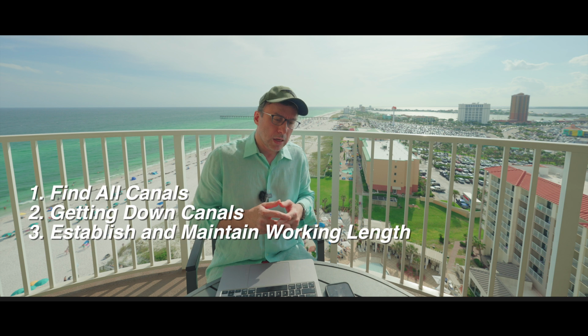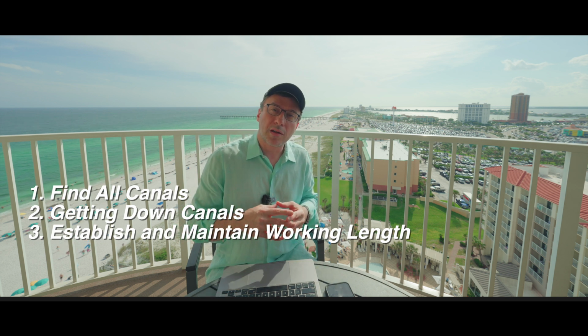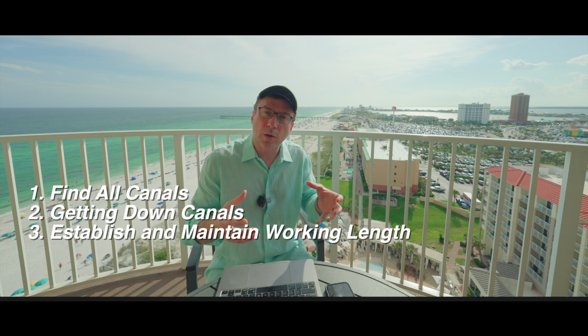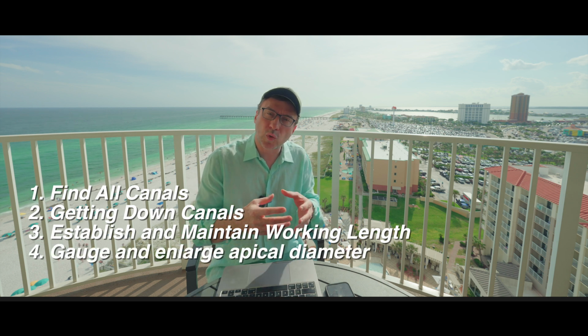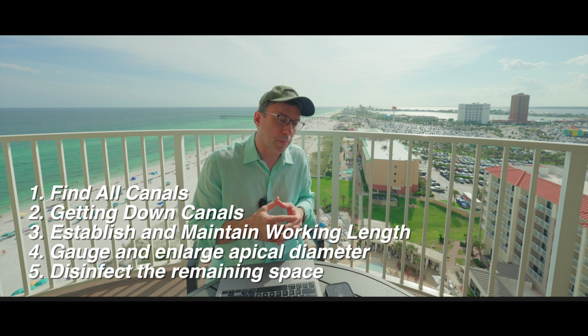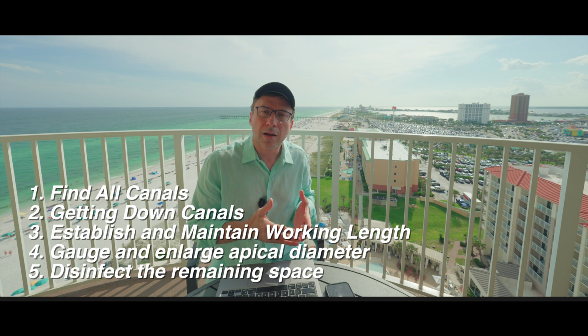And then once that very most important part is done of getting down to the end of the root, achieving length, maintaining length, and then enlarging the apical diameter to an adequate anatomical size in which we get rid of the biofilm and the microbes through irrigation and this biomechanical instrumentation, then how do we obturate the root canal from that point on?